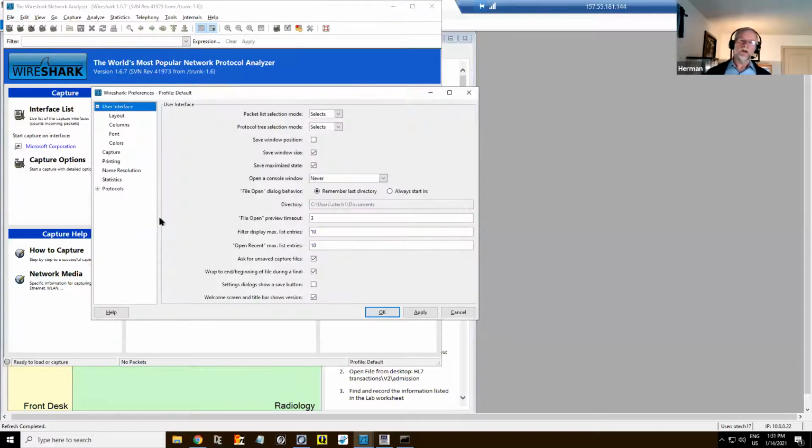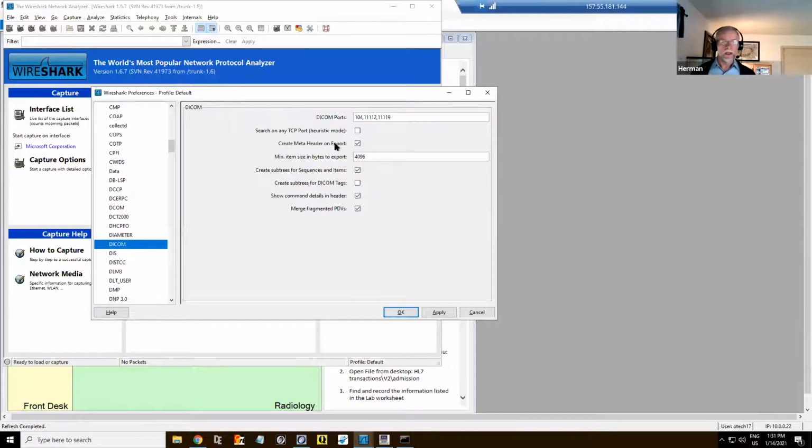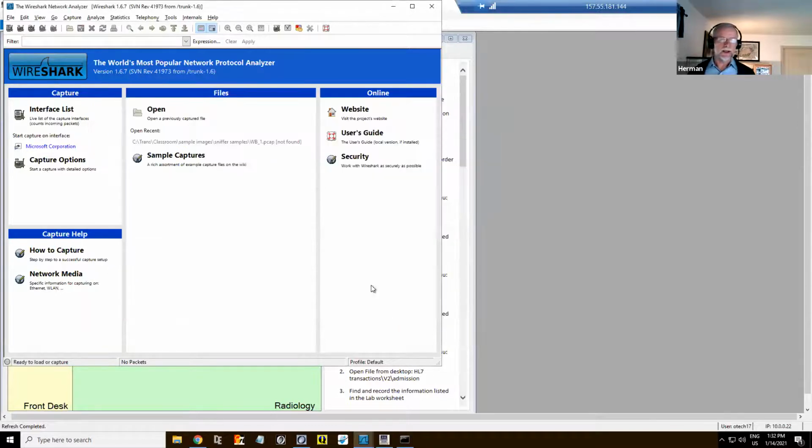What I need to do is connect the sniffer port to the appropriate protocol. I click on protocols, and it's amazing how many protocols it supports. I didn't even know there were so many. I probably know only a handful of those. But anyway, DICOM is what we're looking for. I added ports 104, 11112, and 11119. 11119 is the one I added this morning because that's the port number of my PACS. That's how I configured my PACS, 11119. So we don't need to do anything, it was still there. So I know that when I make a connection to that port number, I will be able to capture it in Wireshark. So we set up the preferences.